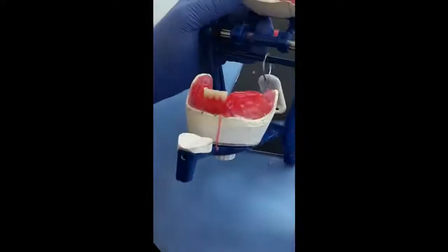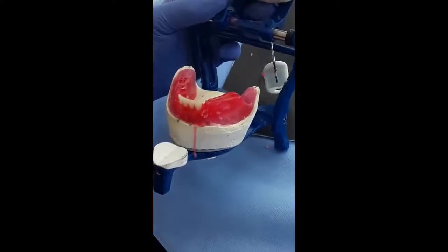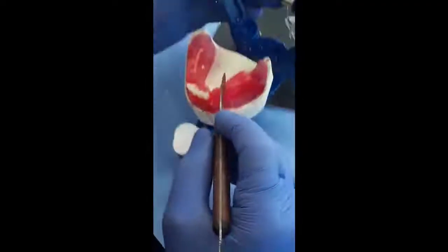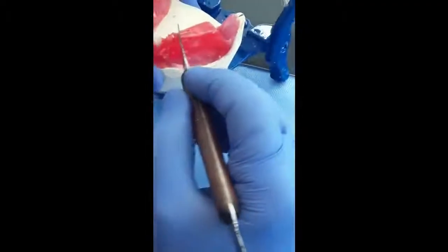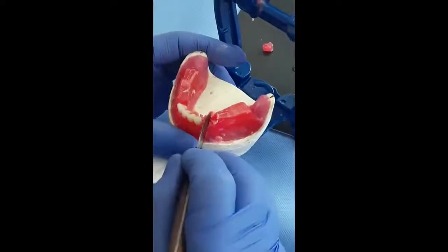Now I proceed to the setting of the canine. As you remember, we said that the canine will be lingually inclined buccolingually, and from the labial view, the neck will move distally a little bit more than the lateral.